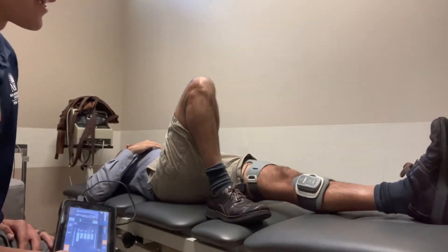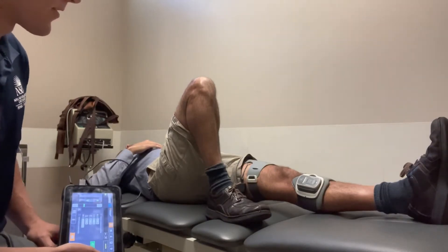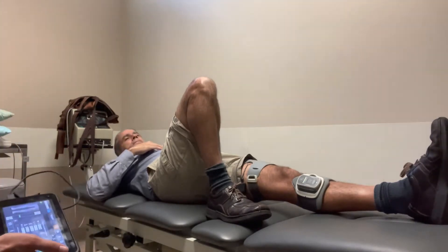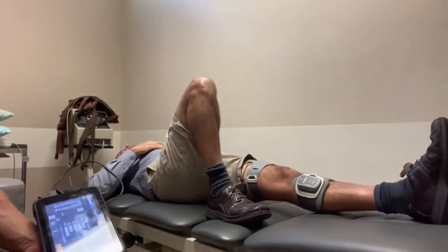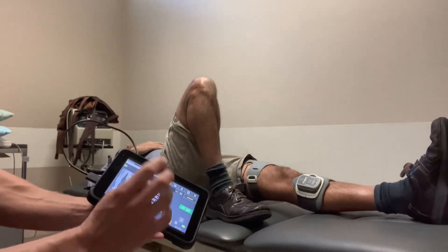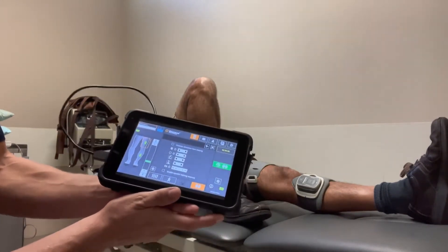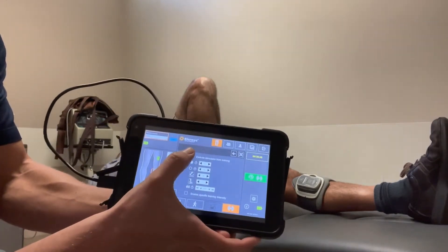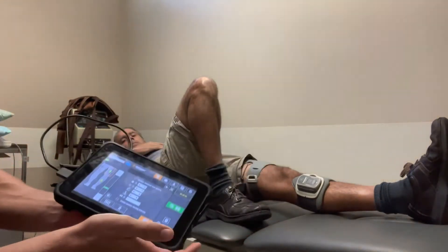Hey everybody, we wanted to show y'all a quick video of some of the common ways to use the thigh cuff for different training mode exercises that can be used in the clinic. We have Brian here as our patient. We're going to start in supine position. Because we may use the lower cuff for motion detection later on, we have the lower cuff paired — this is not a thigh standalone cuff. We'll exclude the lower cuff stimulator from training so we can isolate just the thigh cuff for training mode.